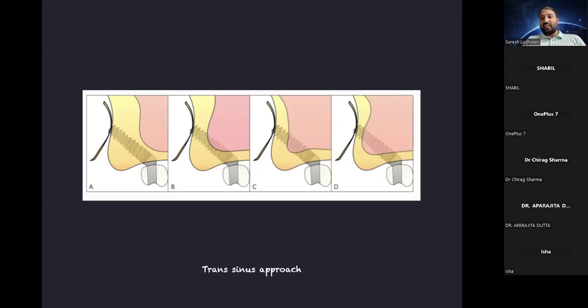And the second thing is about the prognosis or the future longevity of such implants, which is again a questionable thing. Because the literature do say that they are successful, and there is literature which says that their survival rate is a little less. But people do it and people do it nicely. I don't have such exposure to such kind of placement.